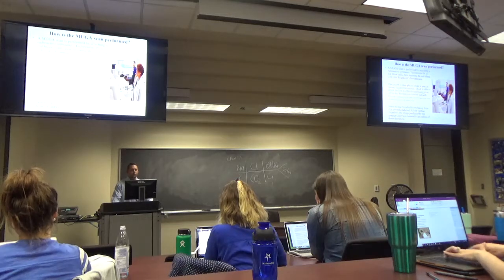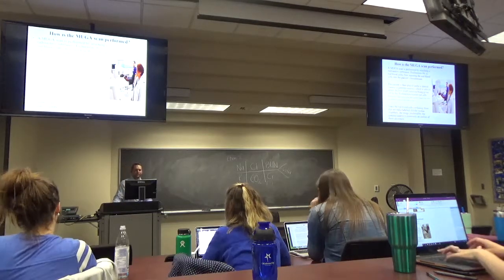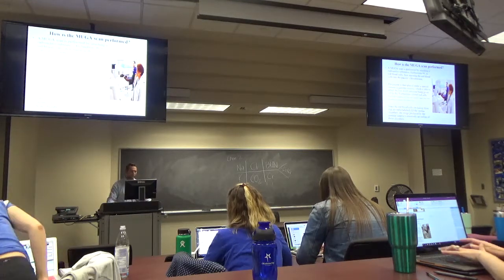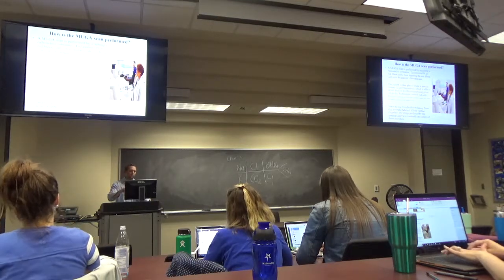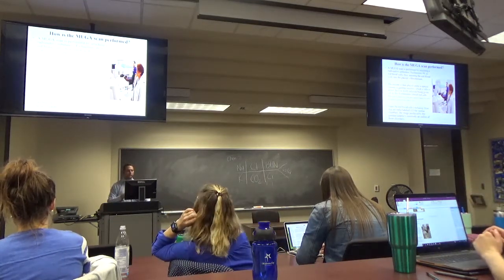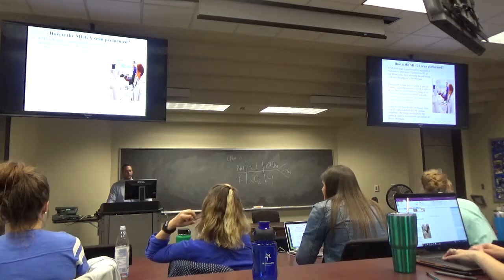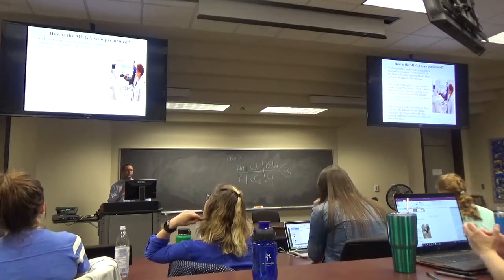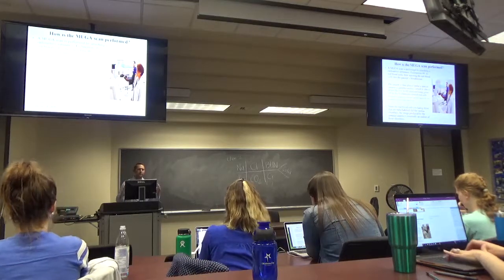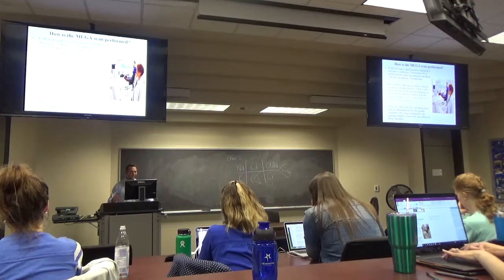So how this is performed is you attach a radioactive substance, Tech-99, the same stuff we were talking about earlier with the Sestamibi scan. You attach the Tech-99 to red blood cells and inject it into your bloodstream. You have this gamma camera in front of you, which is the thing over this guy's chest right here. As your heart's pumping, a gated sequence, which is partially what's in the name of MUGA, however you want to call it, means that it's taking precise images during the cardiac cycle. So it might be just in diastole or just in systole, and that gives the patient a lot less radiation. That's why it's gated.